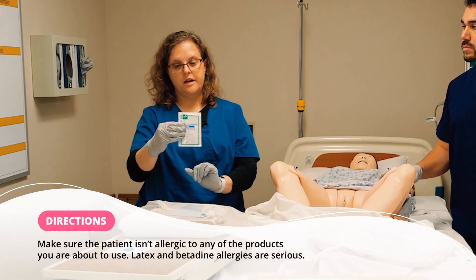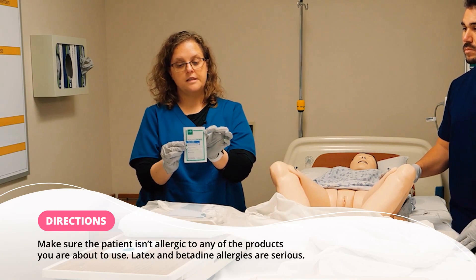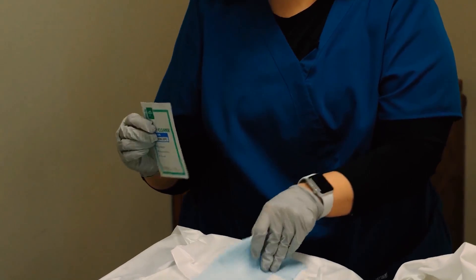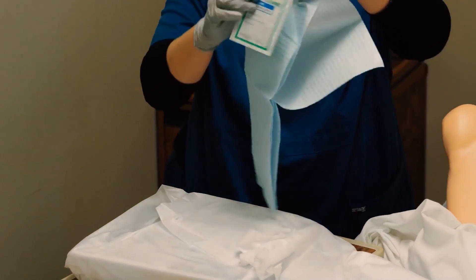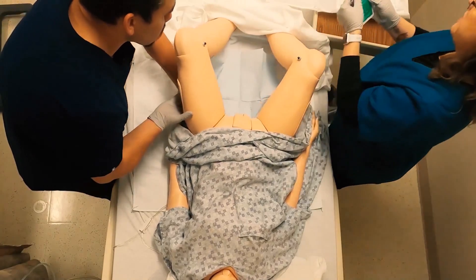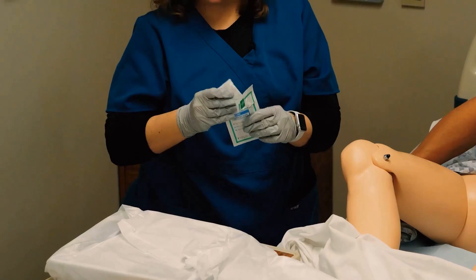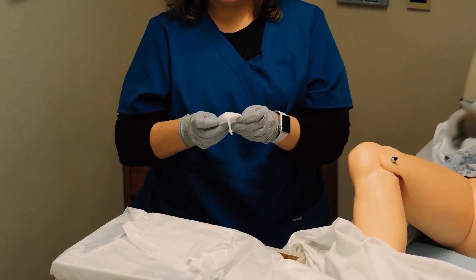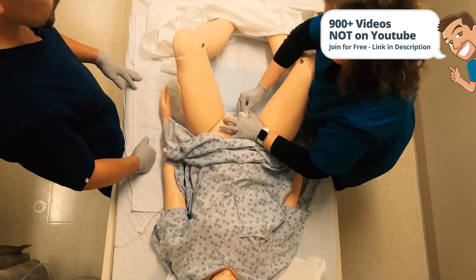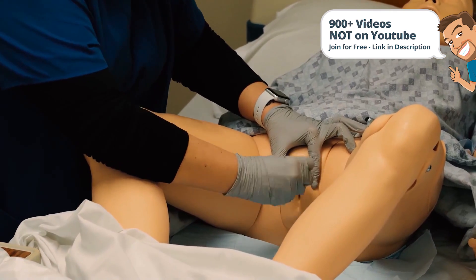This kit has a little PeriCare kit in it, and most of the newer packages do come with this. If your package doesn't have it, you can also use a washcloth to clean your patient. This is just a simple waterproof pad. I only need clean gloves for this — it's basically a dirty procedure, just to wipe away anything I'm worried about. If the patient had feces, you would wipe that away before getting to this part. Because this is clean, I can continue to fold it to make sure everything is clean.